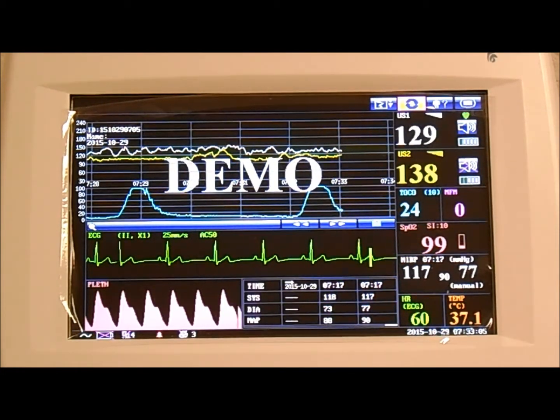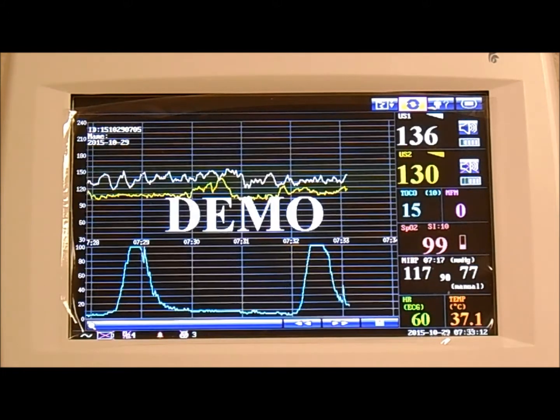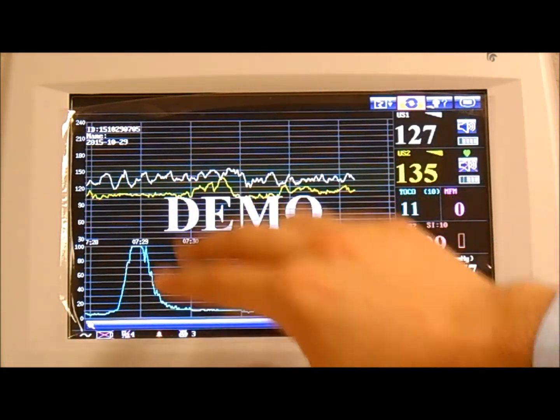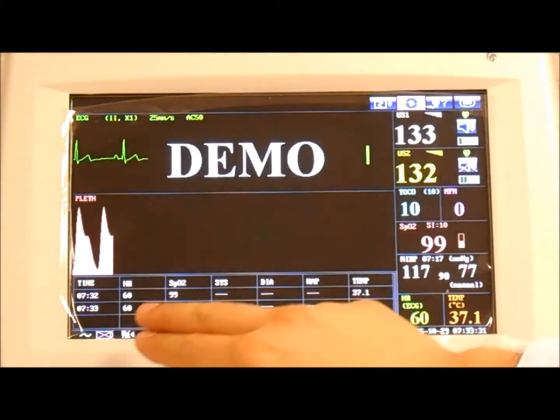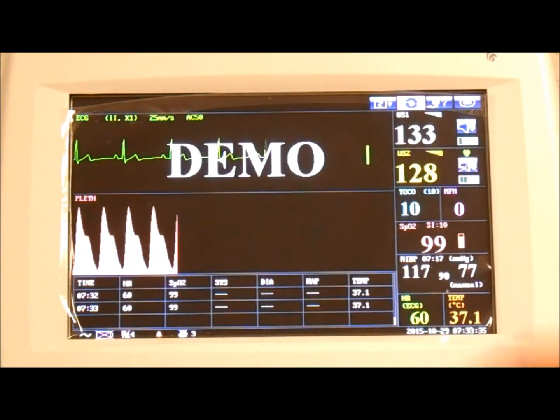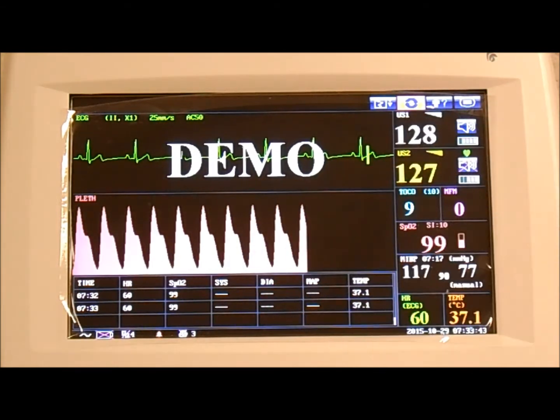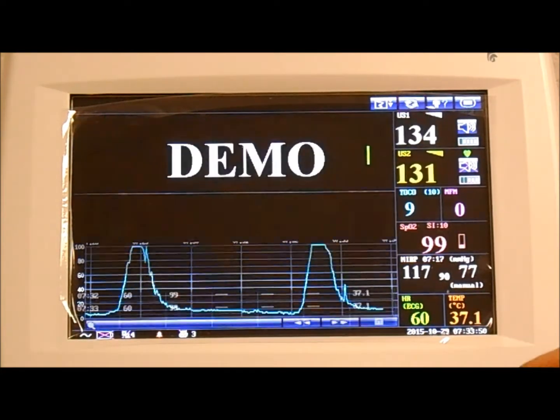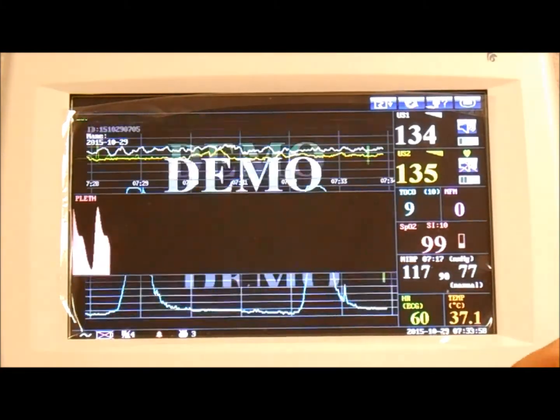Next we have the screen adjustment icon. So if you press this icon, again we use the knob to navigate when it's highlighted. If you press on it, you can go through different screen displays. There are 3 different options. One, it'll give you only the fetal parameter, so only the FHR and the toco. If that's all you care about, you can set it to that display only. If you press on it again, it'll go to your maternal parameter, so that's the mother's ECG and SpO2. Or we have the fetal plus maternal view. So again, we have the fetal parameter view, the maternal view, and a combination of both.